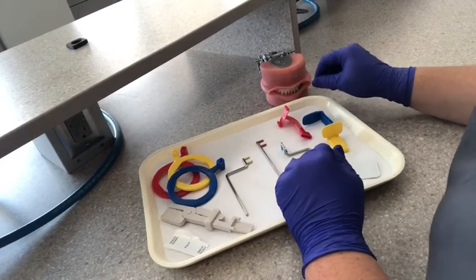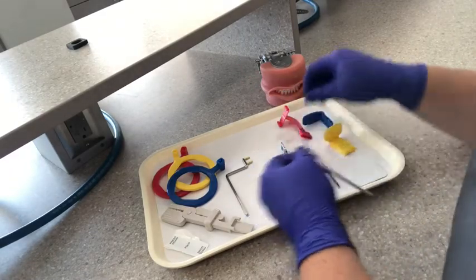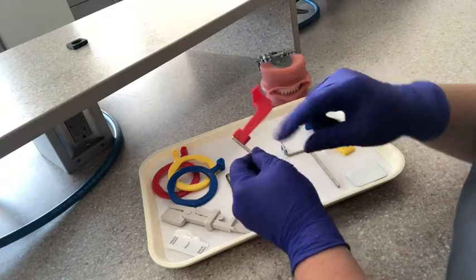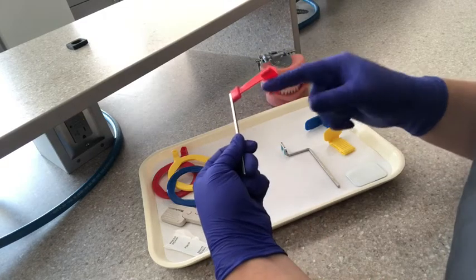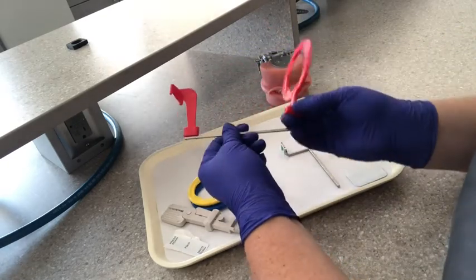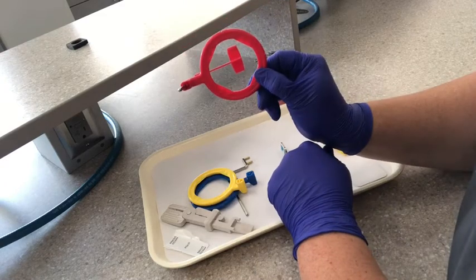The third one here is the bite wing XCP setup. We're going to grab the straight bar for the bite wings and this bite block here. We want to make sure that the portion that holds the film is going away from the bar — we don't want it going towards the bar, that's backwards. You're going to grab the same ring you used for the anterior PAs — the straight-nosed ring. Make sure that you're able to see the bite block centered in your ring.